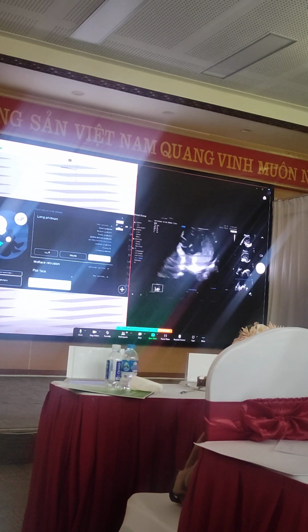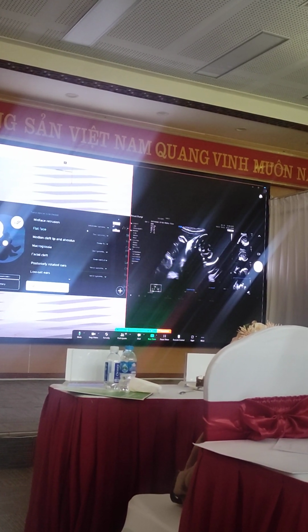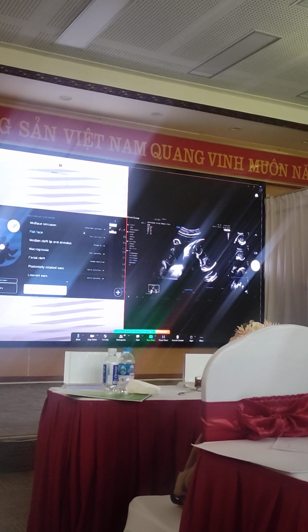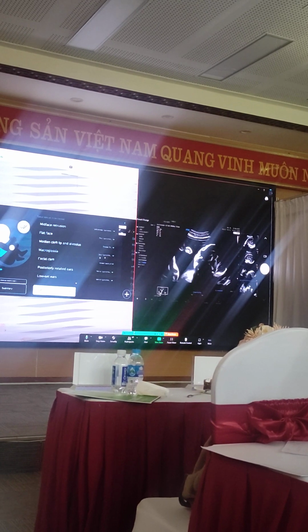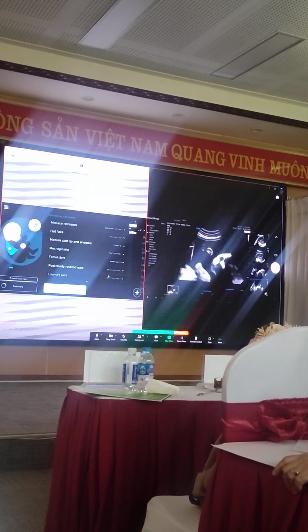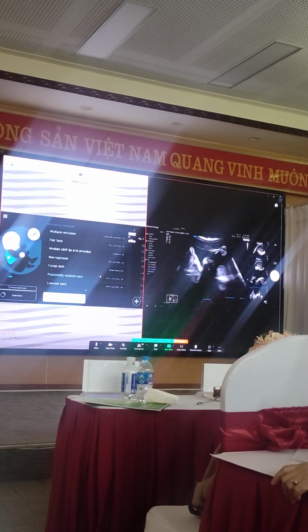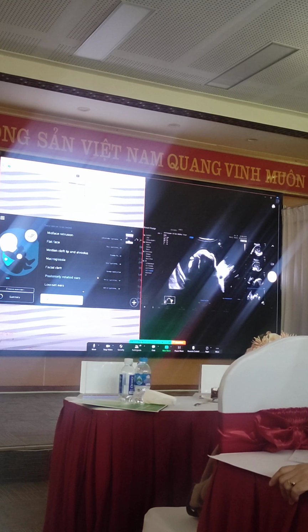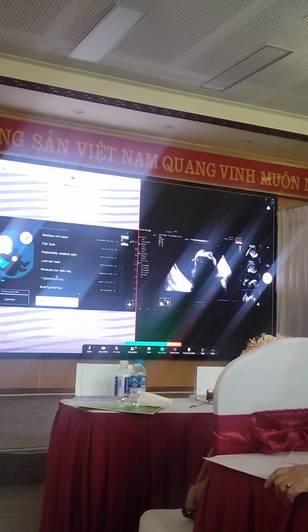So you can't really see the hands, but unfortunately, I'm giving a hard time to this charming lady because I'm moving a fetus all around, I'm pressing and moving, and she's still smiling, so she's very kind to us, I think. But you can't do obstetrical ultrasound without moving the fetus around, you can't get anywhere with that.